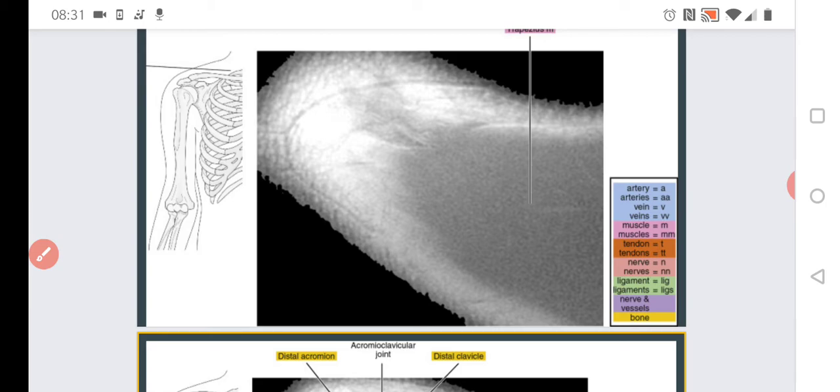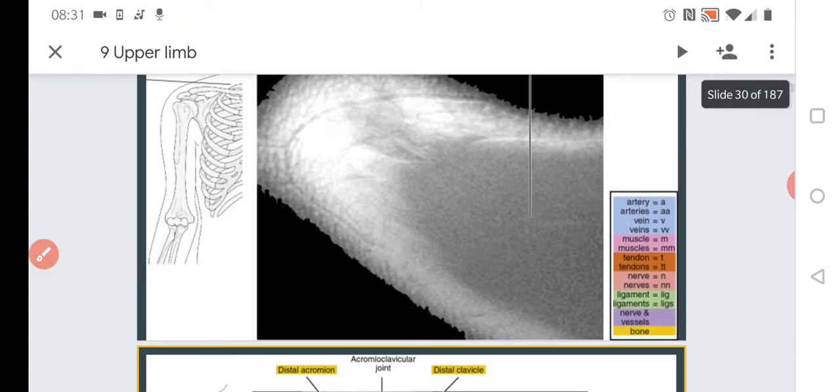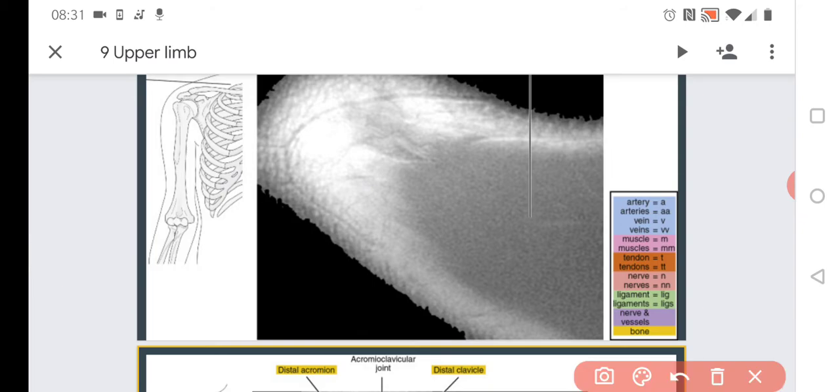And so what we can see here is just basically the skin. And we see the beginning of the trapezius muscle. Now, what else is important?